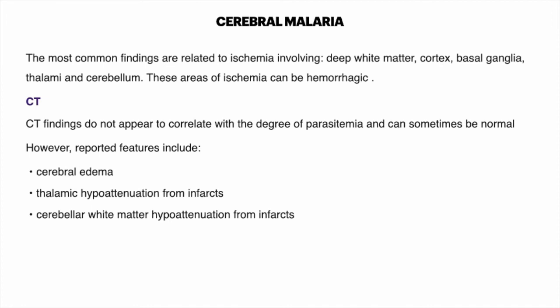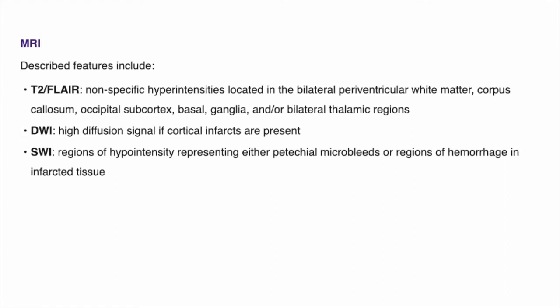But above all, we have to request the B scan. I think the diameter of the nerve sheath is more predictive than the CT scan itself. Also, the MRI is very good in this case and very important, but not all facilities can provide MRI.